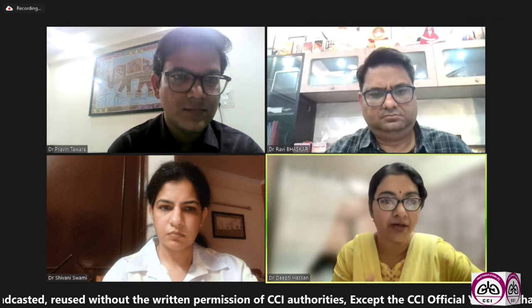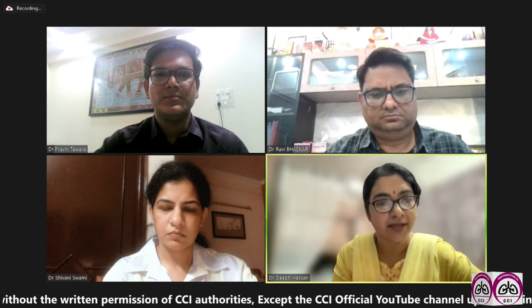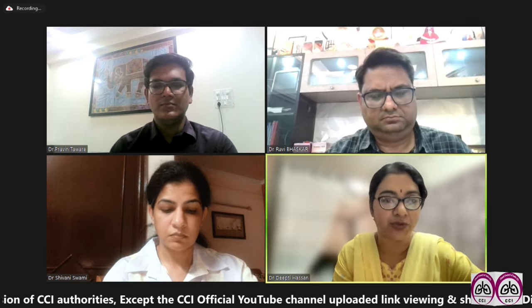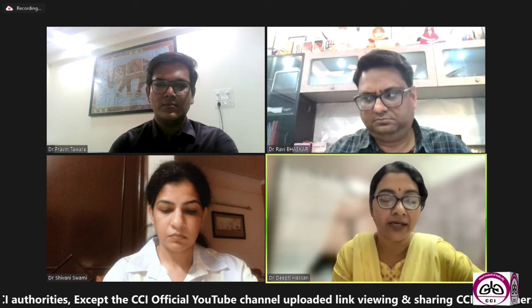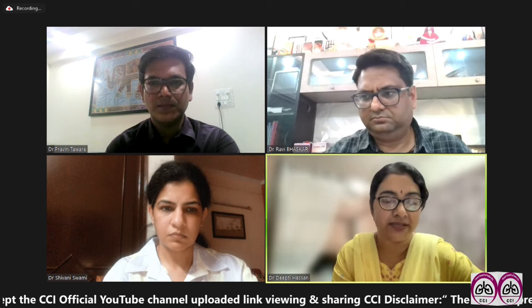So when it comes to a conscious patient, the next point to consider is whether they have good hand-to-mouth coordination. If that is there, then again, the options are more. We have the option of giving an MDI. We have the option of giving a DPI, a breath actuated. Everything is there. But if that is not there, then we have to think of spacer and add-on devices.